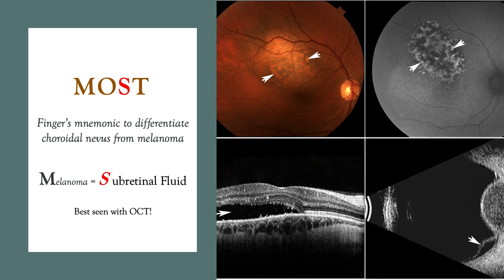Next, let's talk about subretinal fluid. Subretinal fluid can also be seen on the fundus autofluorescent image on the top right. You can see a dark demarcation line extending down from the tumor — the tumor is leaking. However, it's on the OCT where it is obvious that there is subretinal fluid, and the photoreceptors look dysmorphic, suggesting that the fluid is toxic to them.